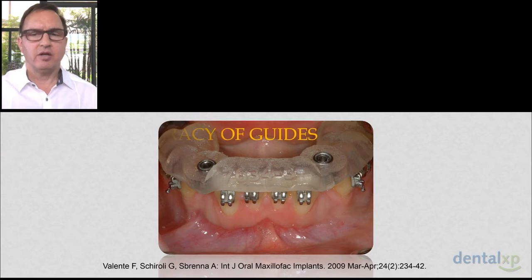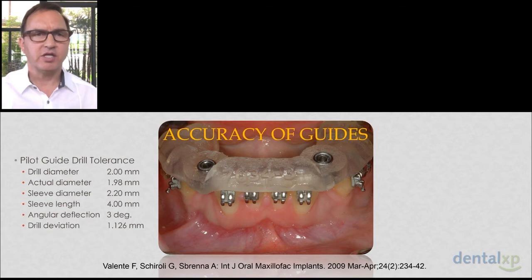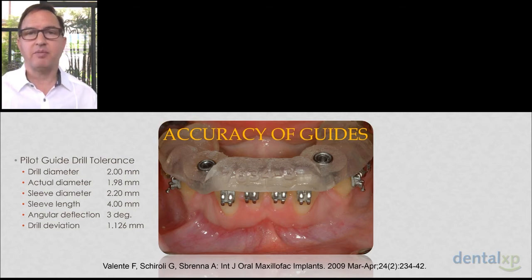So that reveals an inherent revelation, essentially, that there is a three-dimensional space we're studying, and although we could place an implant, we might not be able to execute that without the assistance of a guide. But one must ask the question, are the guides really that accurate?